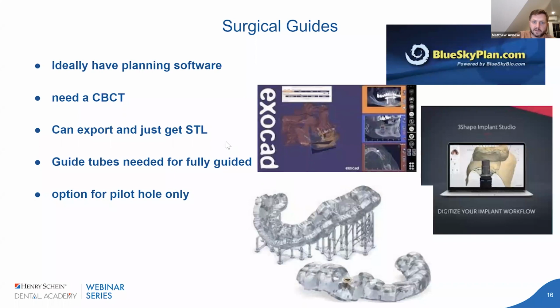Know if it's keyed, know if it's keyless, but we're not going to spend too much time there. There are plenty of tutorials and plenty of implant planning and surgical guide softwares out there, but it's one of the things that we use day in, day out. We take an STL, we take a DICOM, and I go for exocad, 2.0 or 2.5, pilot only. So that's where we use it day in, day out.